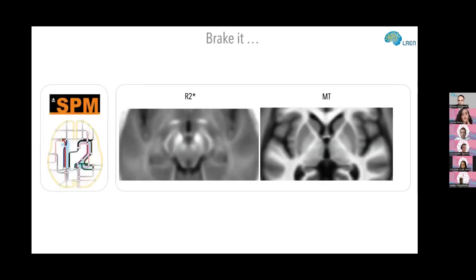When I saw these images, I thought: finally we have a good contrast for the structures I was so interested in — the basal ganglia. For the first time, for somebody who had previously worked with T1-weighted images, I was able to see the pallidum, the substantia nigra, red nucleus, and so on.